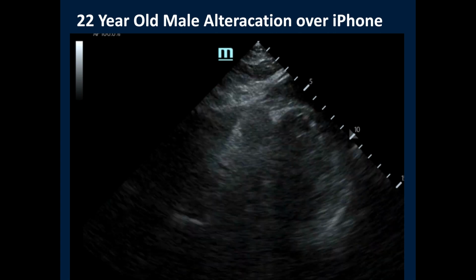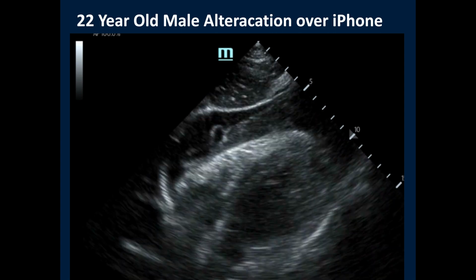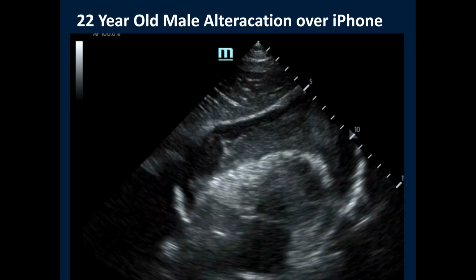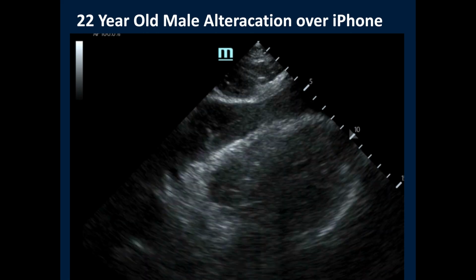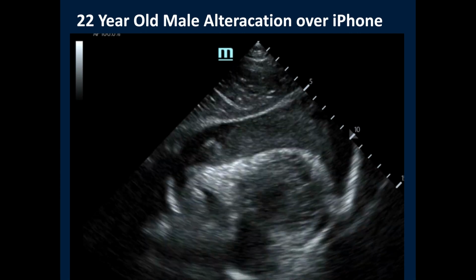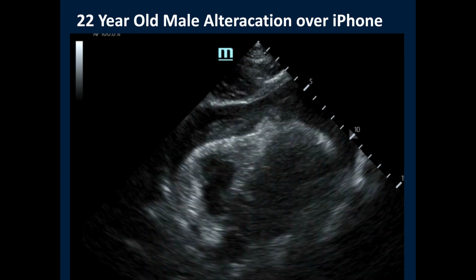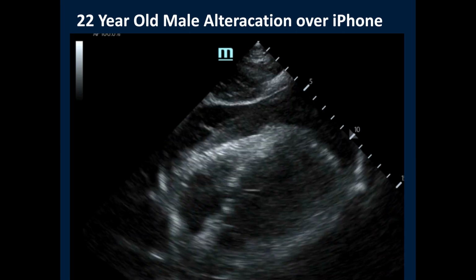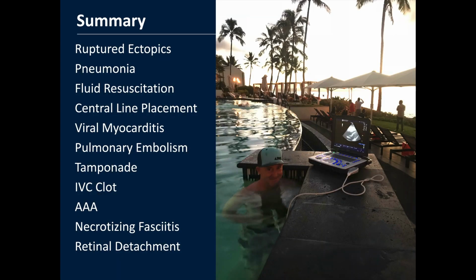The pericardial effusion, that's something that we can fix with a needle, but a clot, you're going to need a thoracotomy and a window for that. So this person had very low blood pressure. They were kind of going in and out of consciousness, and we made the diagnosis of pericardial tamponade right away from the stab wound to the chest. Patient went for a thoracotomy, not in the ED because they still had a blood pressure, but in the OR, which is a way better place to do a thoracotomy.